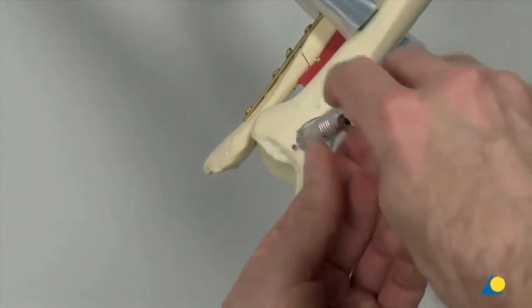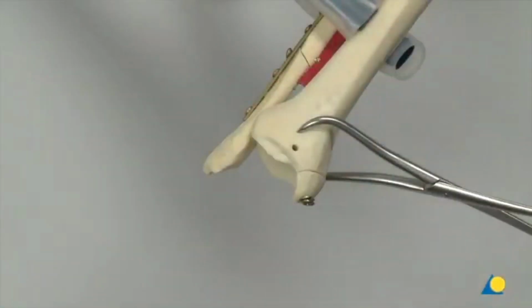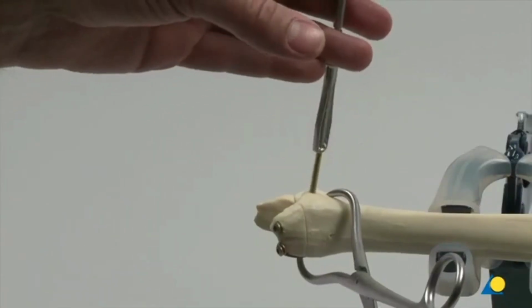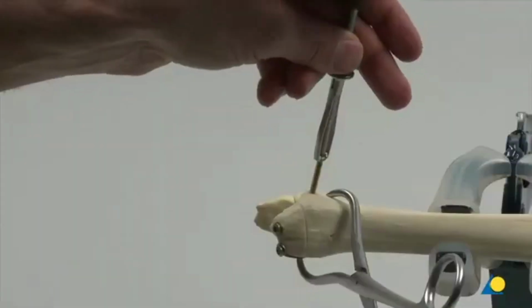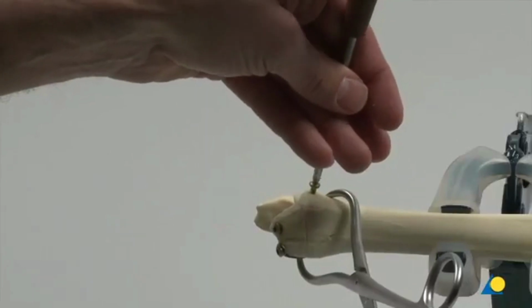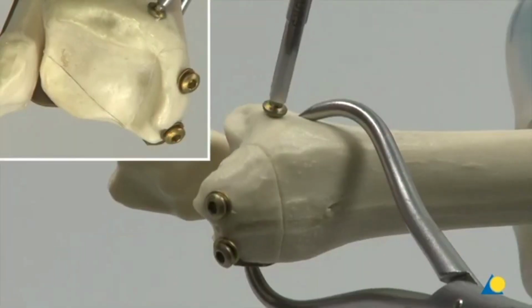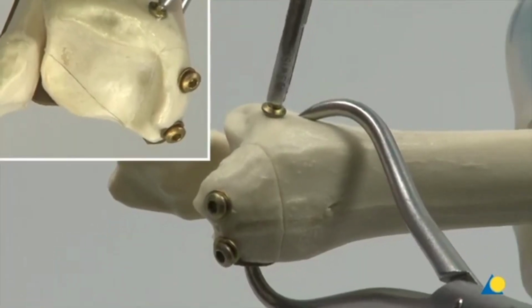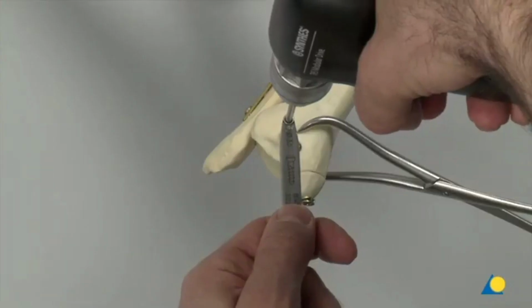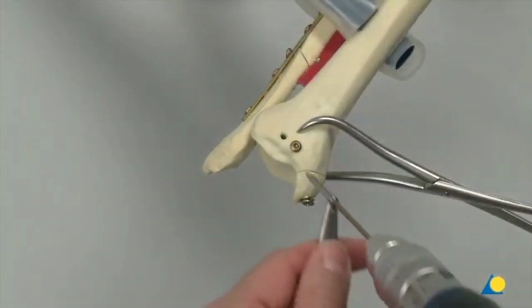The depth gauge is used to measure the required length of the screw. The hexagonal screwdriver is used to insert the 3.5 mm self-tapping cortical lag screw. The compression effect is clearly visible at the fracture line. If necessary, a second 3.5 mm self-tapping cortical lag screw can be inserted parallel to the first to protect the fragment from rotation.